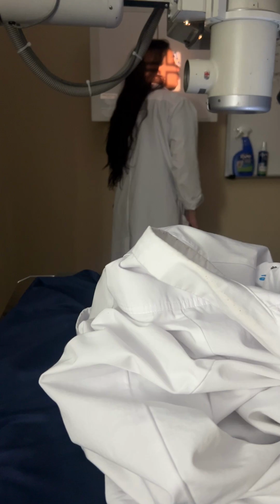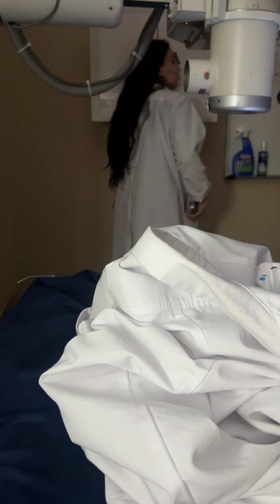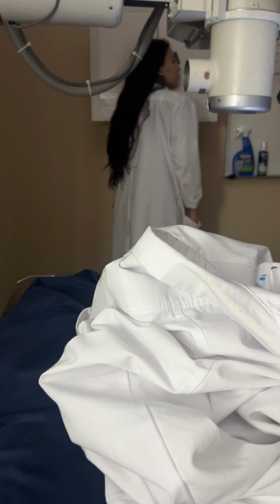Basically centering on the surface of the zygomatic bone in between the outer canthus and the EAM. Okay? So between here and here, the cheekbone is the zygomatic bone. Okay? That sounds better. Change that.